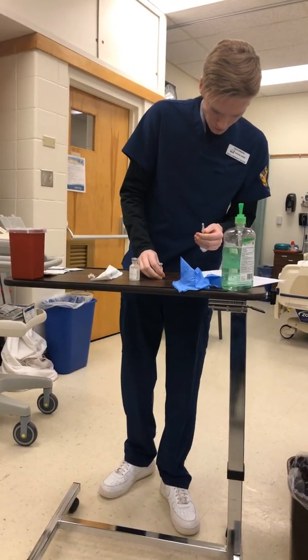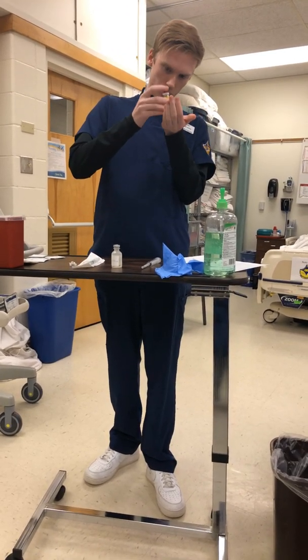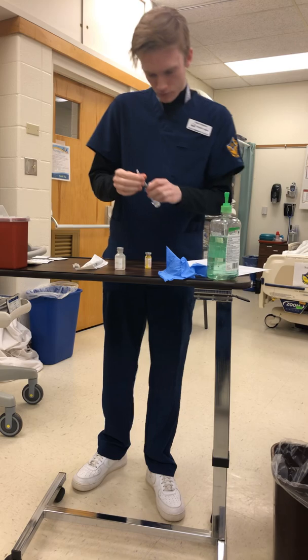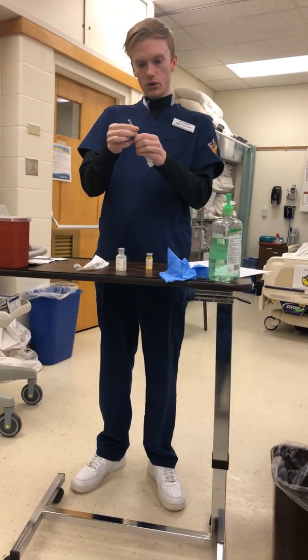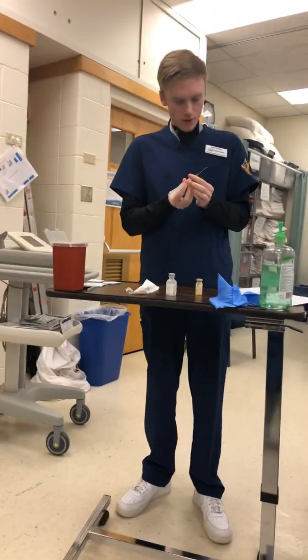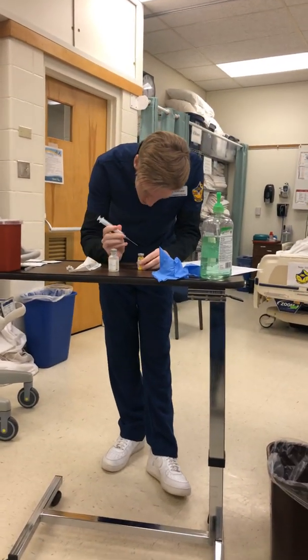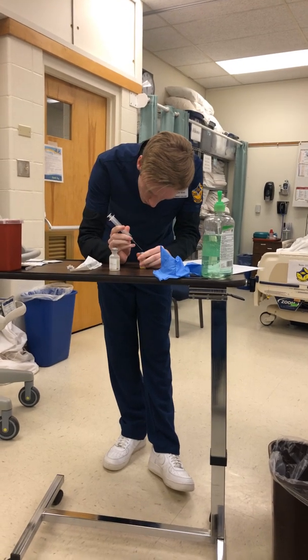And then make sure that all the powder is at the base, which it is. Now we take off the needle. We'll take off the cap to the needle and withdraw 5.6 mils of air out of here.